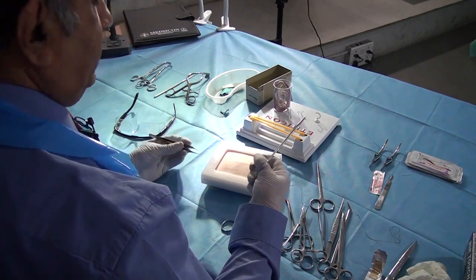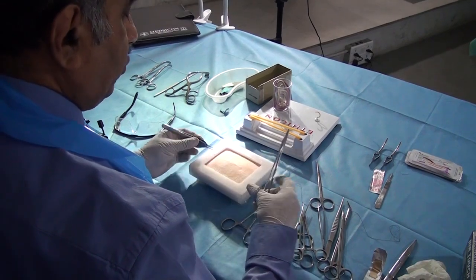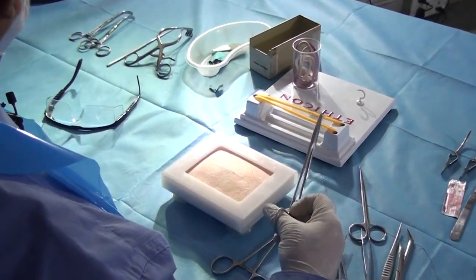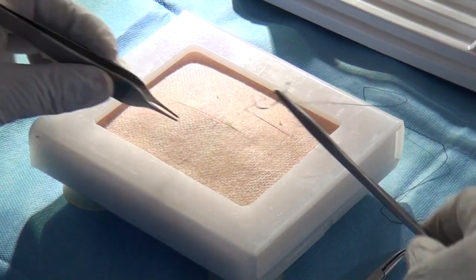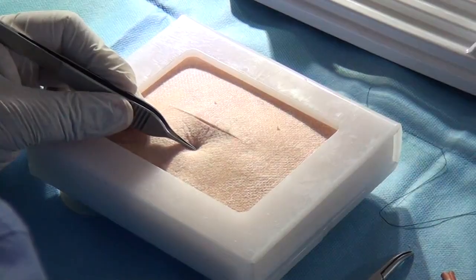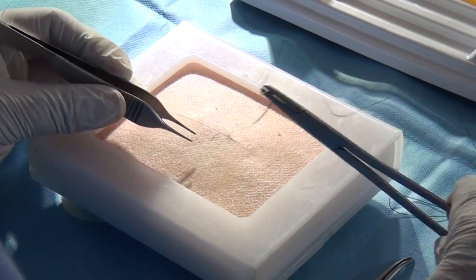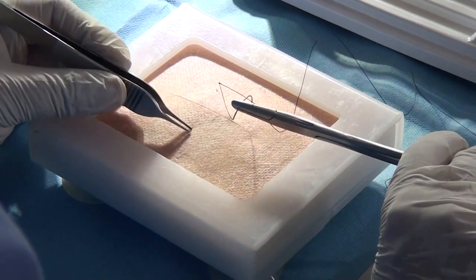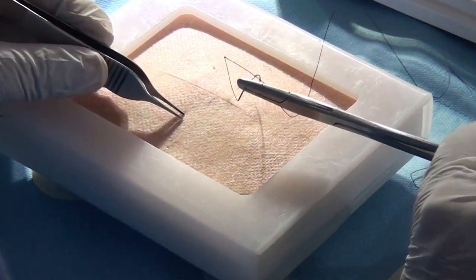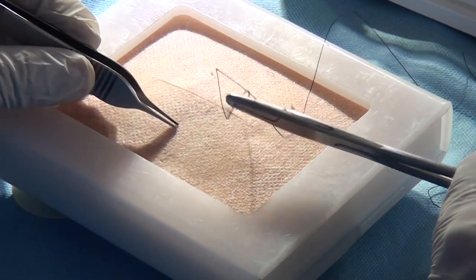The needle is grasped. I'm just showing you one bite, and then two exercises will be done simultaneously because we missed the first one. Watch carefully. How do you put a suture? Remember, the needle should be entering the skin vertically. And how far should the bite be?